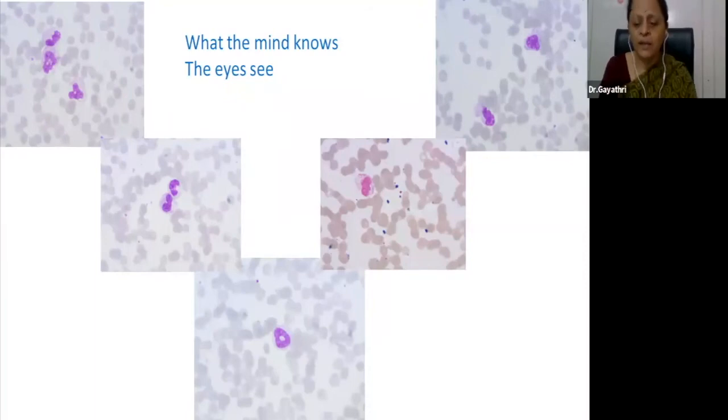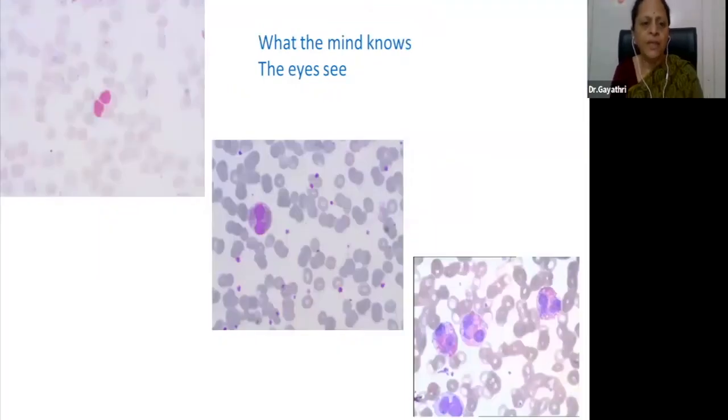Depending on that, you could read them as abnormal granulations. Should become familiar with that. Now look at this abnormality. I'll start with this. This is, of course, a very classical cell, a spectacle-shaped cell with two nuclei that are nicely separated with a link between them and bright red granules, a nice, beautiful eosinophil.